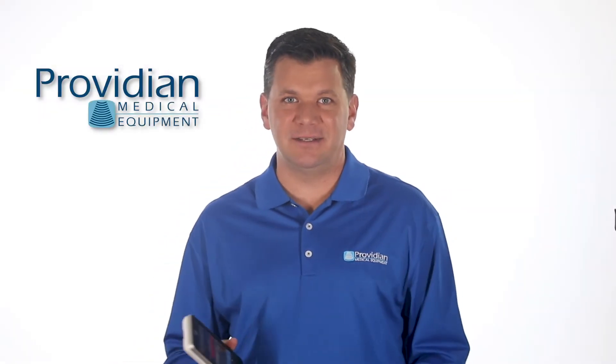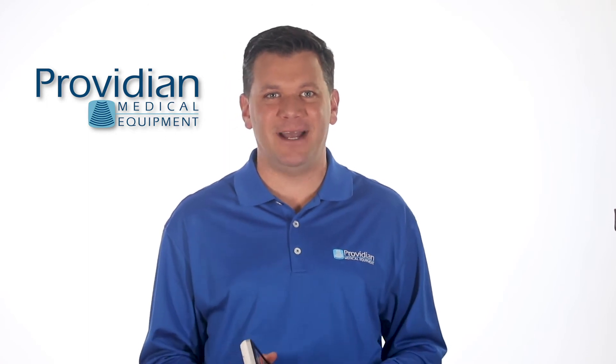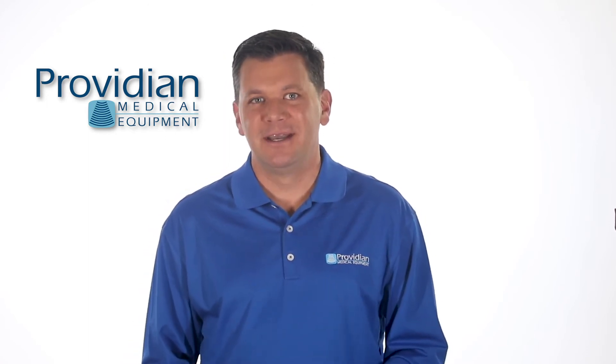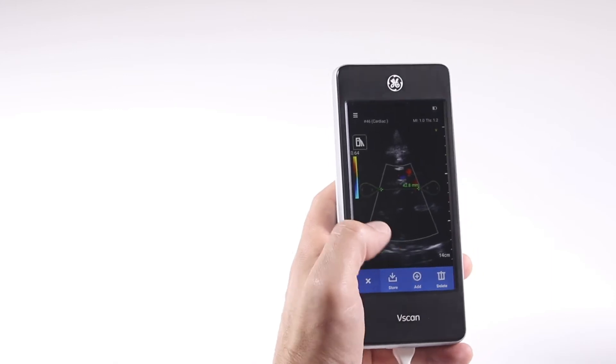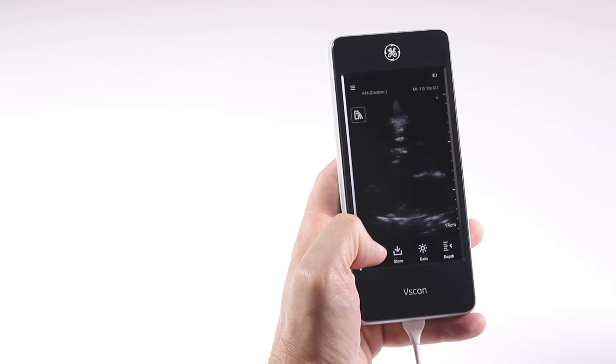If you expected poor imaging quality, you'll be pleasantly surprised. The system does a pretty good job of getting an image. The color image and frame rates are better than what you'd expect from such a small machine. You can also make simple distance measurements, and it has a number of tools that you can download from the GE app marketplace.